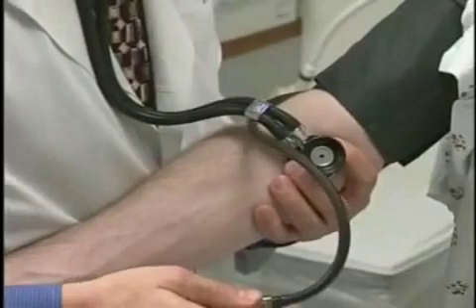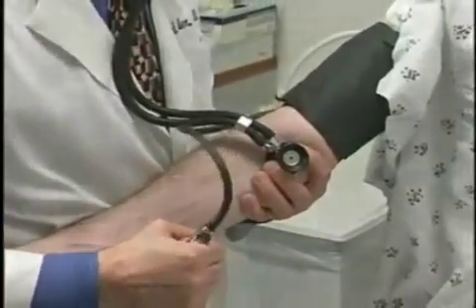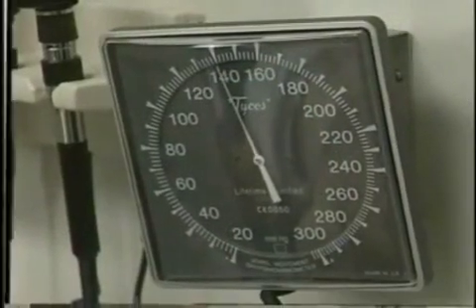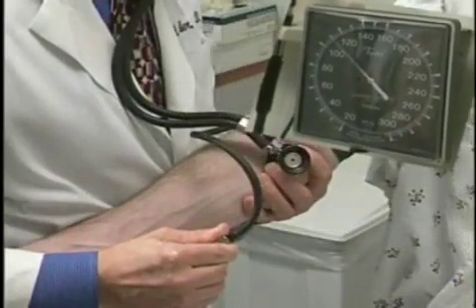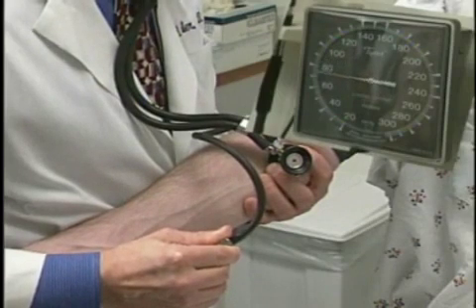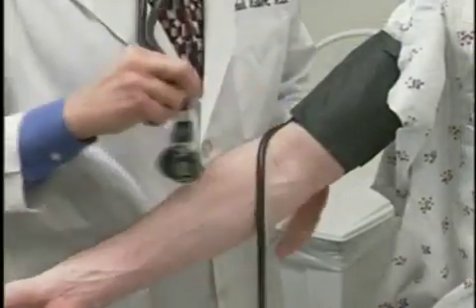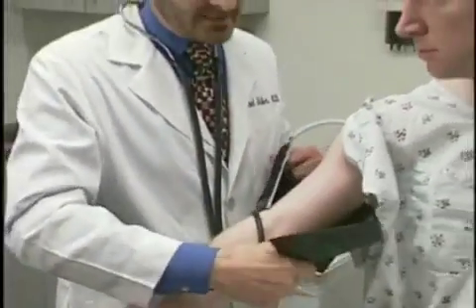So close the cuff and the valve, and then slowly blow it up again, about 20 points again beyond where I felt the blood pressure disappear by palpation. I'm going to slowly release the air. The point at which I first heard the blood pressure pulse return was 116. The pulse disappeared at approximately 76. So the blood pressure by auscultation is 116 over 76.